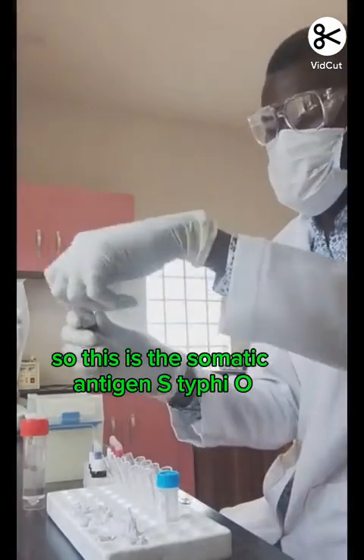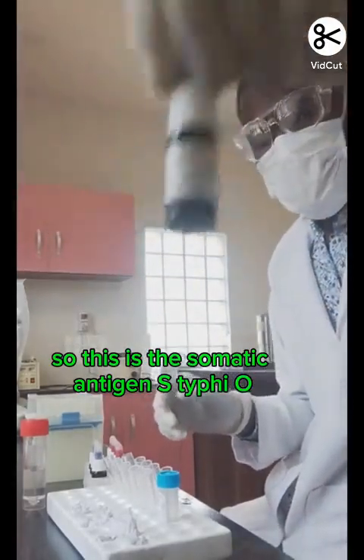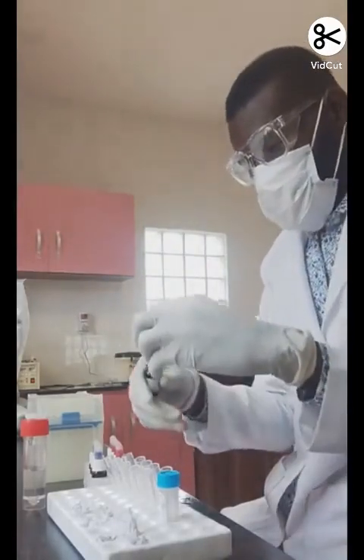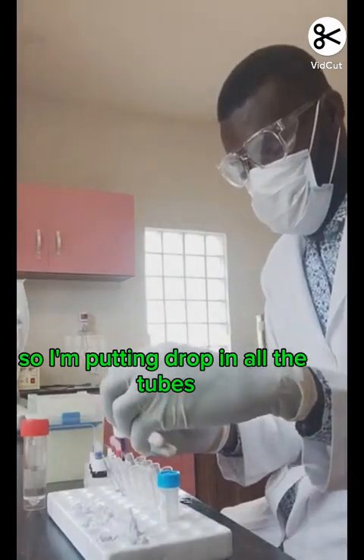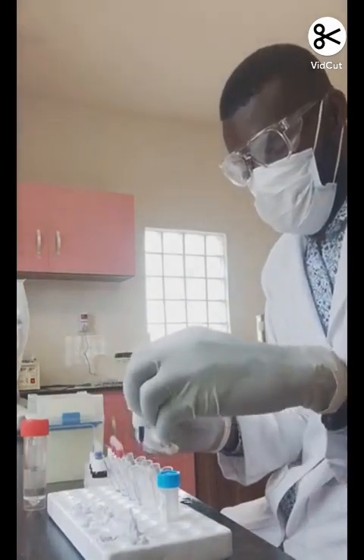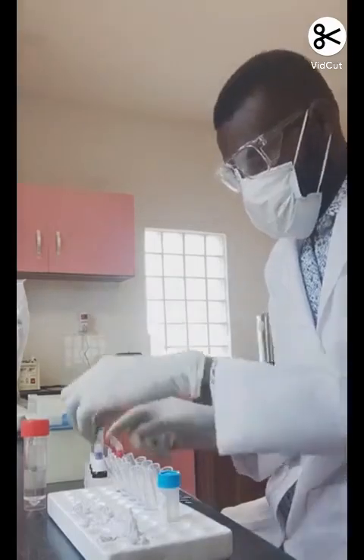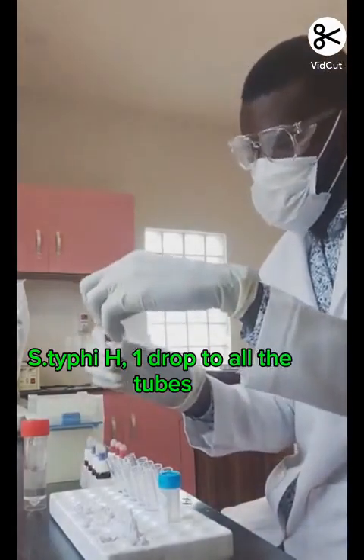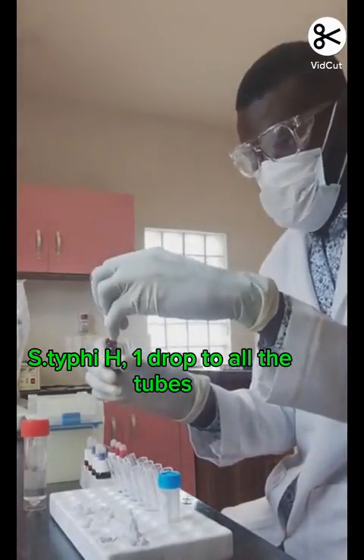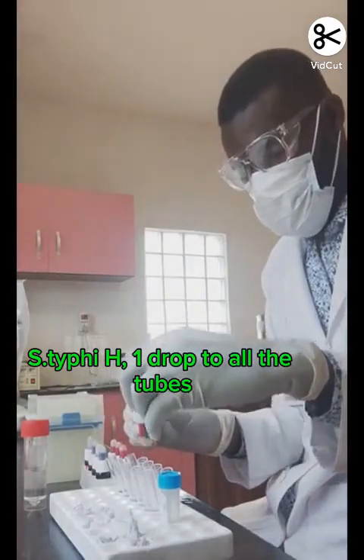So this is the somatic antigen S-typhi-O. So I'm putting a drop in all the tubes. S-typhi-H, 1 drop in all the tubes.